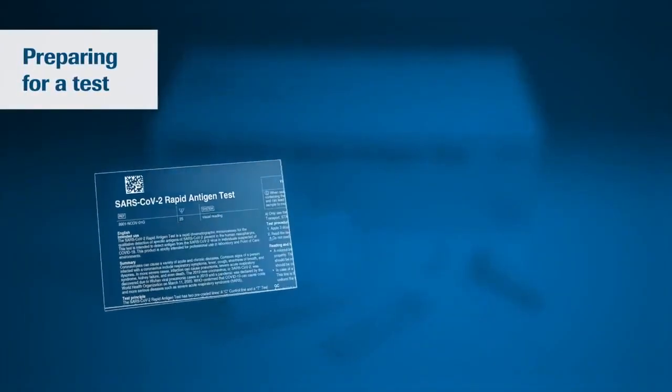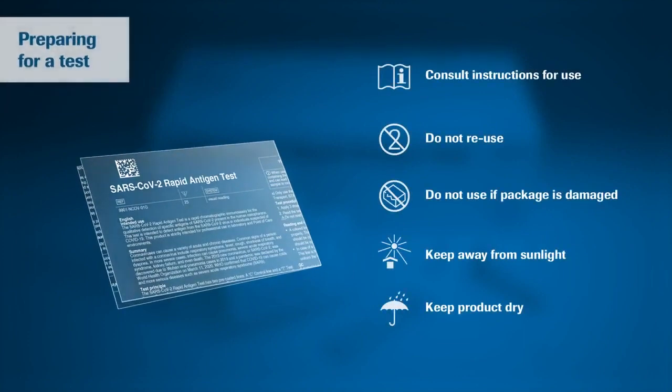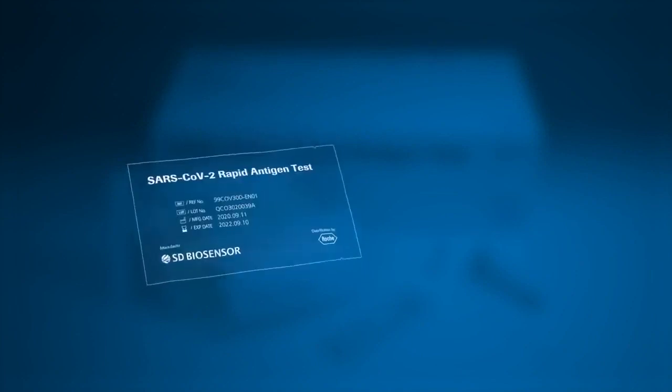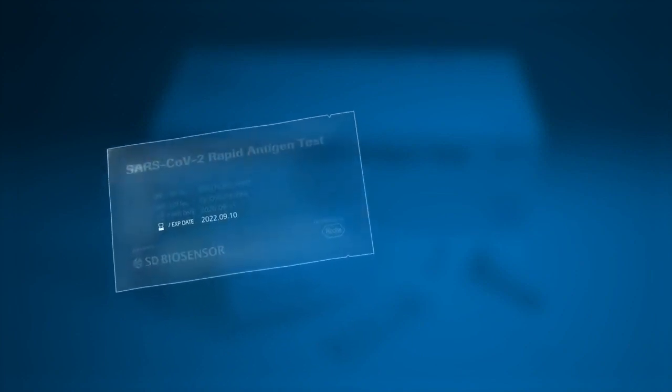Begin by carefully reading the instructions for use for the SARS-CoV-2 rapid antigen test. Use appropriate personal protective equipment and handle all samples as if they contain infectious agents. Before opening the test, check the expiry date on the back of the foil pouch. Do not use the test if the expiry date has passed.